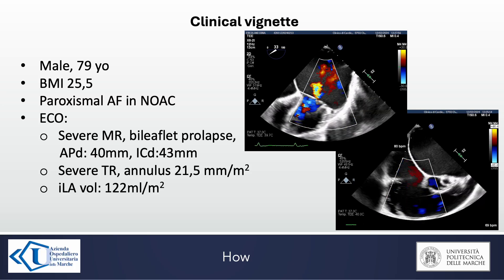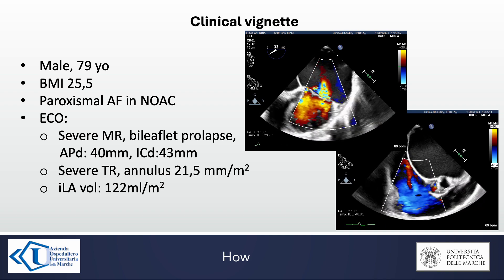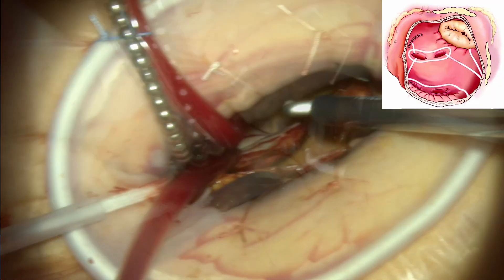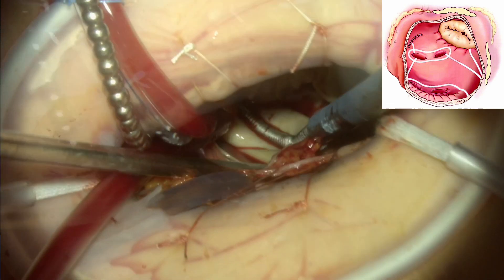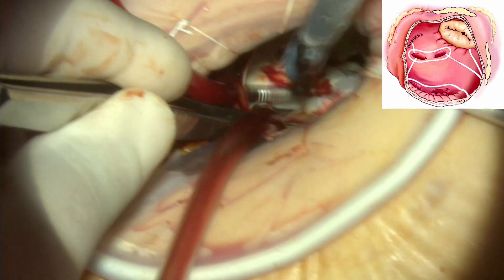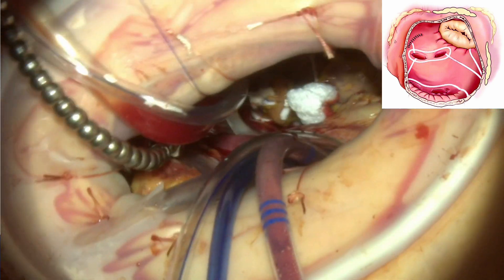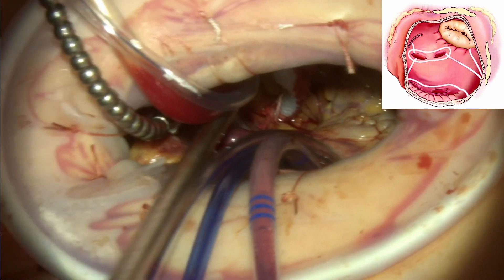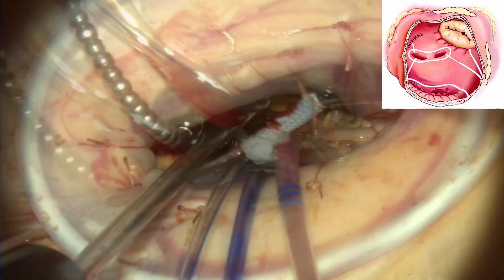This is one case of mitral and tricuspid valve regurgitation, with indication for double valve repair, ablation for atrial fibrillation, and left atrial appendage occlusion. After the valvular procedure, we performed the cryo-ablation following the key lesions of the Cox-Maze 4 procedure, and then we positioned the clip to occlude the left atrial appendage. After the release of the clip, if we notice incomplete closure of the appendage, we can gently adjust the final position with two forceps, as we did in this case.